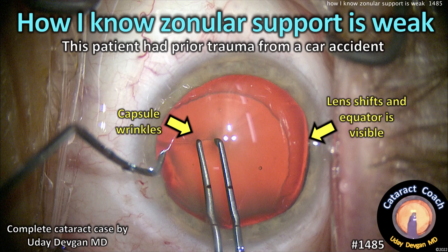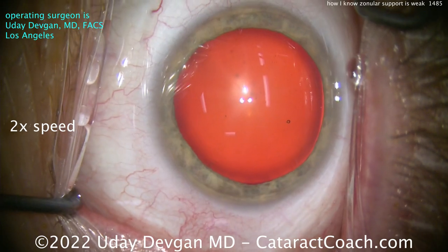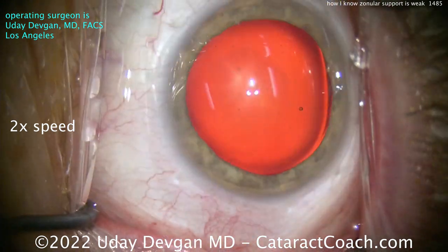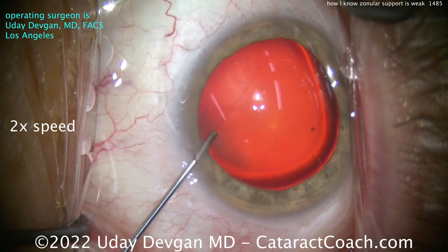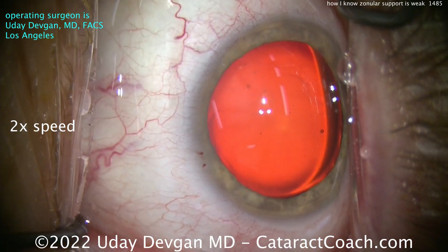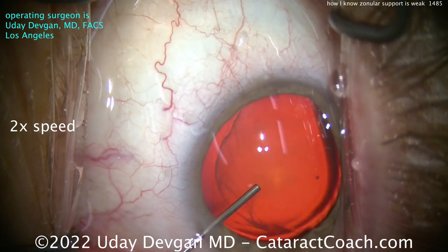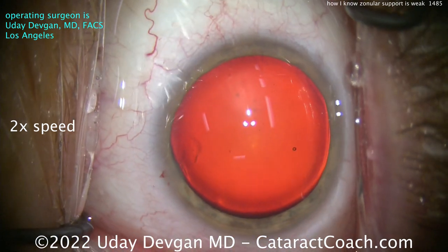cataractcoach.com — how I know zonular support is weak. This patient had prior trauma from a bad car accident. It's an interesting case. I'm going to show you the video two times normal speed. I think it's a normal case — good dilation, not too dense of a cataract. The first hint is here: it looks like I can see a little bit of the lens capsular bag equator there on that bottom right corner.